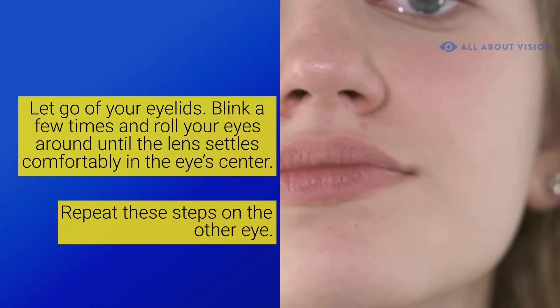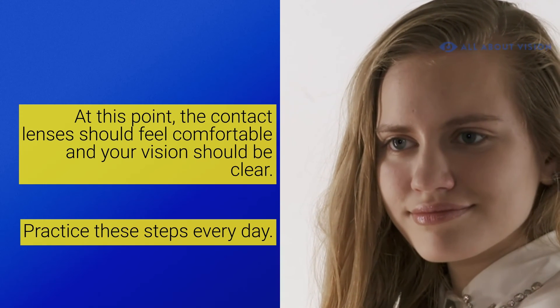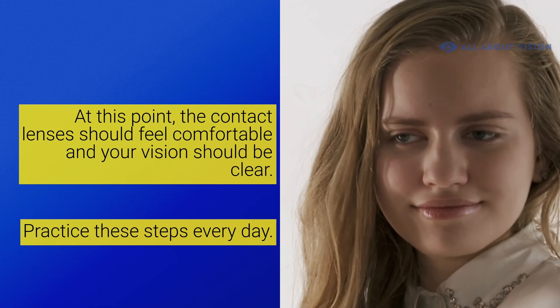At this point, your contact lenses should feel comfortable and your vision should be clear. Practice these steps every day. Before you know it, you'll be a contact lens pro. For more information about contact lenses, visit allaboutvision.com.